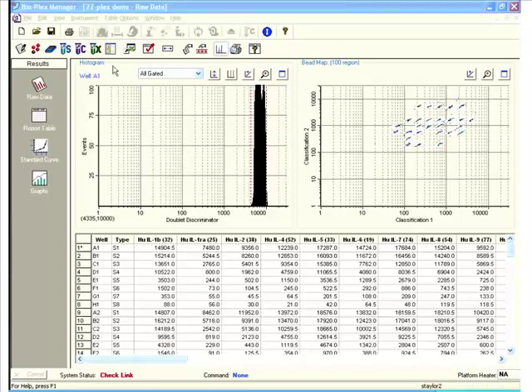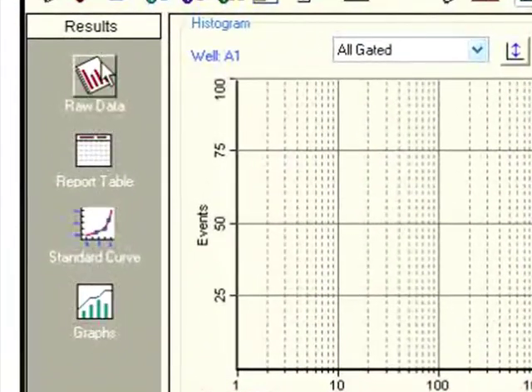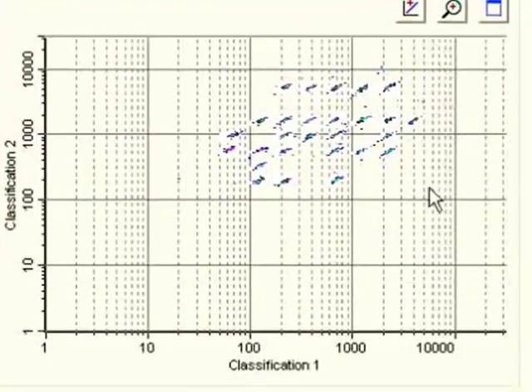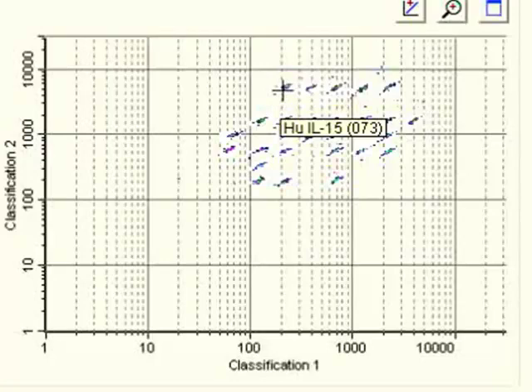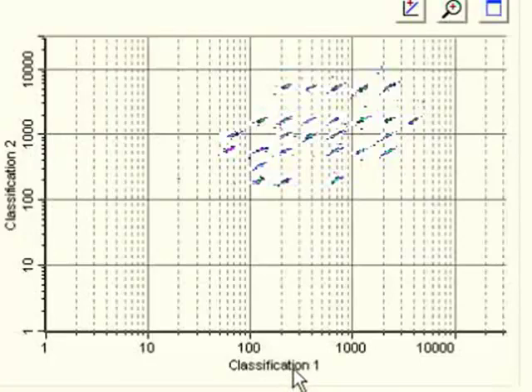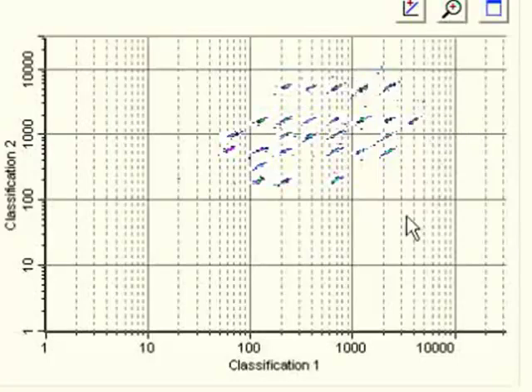I've opened up a data file — it's a 27-plex assay, so 27 cytokines analyzed per sample on a variety of human samples. You can see there are a variety of buttons to go into various aspects of the data, and right now we're in the raw data. These are the bead regions that were used — 27 different analytes. If I mouse over them you can see what they are: IL-17, IL-9, and so on. These bead regions are sorted by bead types — beads with different coatings of classification dye 2 and classification dye 1.